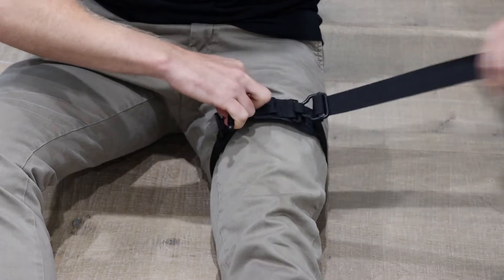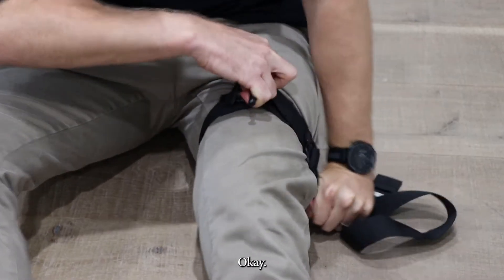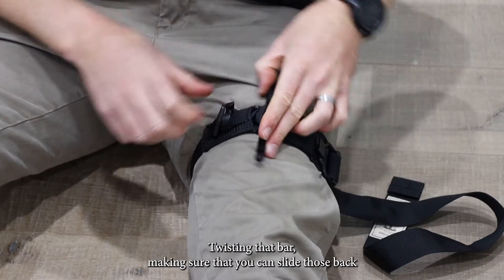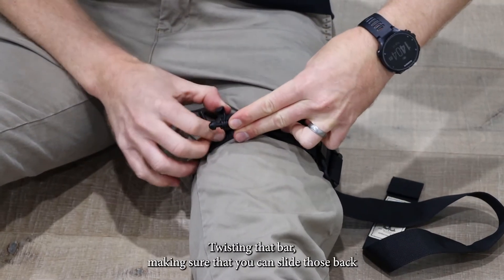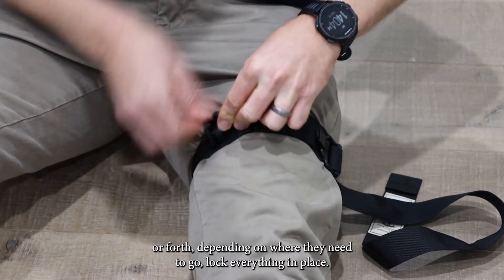Grasp that windlass like a lawnmower, grasp that tail, and then pull down as tight as possible. Twist that bar, making sure that you can slide it back or forth depending where it needs to go, then lock everything in place.